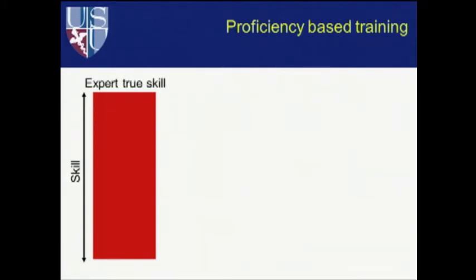So if you have a simulation platform like FLS or FES that has built-in metrics you can measure, you can incorporate this concept that's talked about a lot: proficiency-based training or criterion-based training. There's a bunch of different names that basically mean the same thing. And the concept is this, that any expert at a skill has a certain amount of that skill that they walk around with every day. Any type of validated platform with metrics has the ability to quantify a certain percentage of that skill. How much of that skill gets quantified is going to depend on how well the individual tasks of the training program are constructed, etc. But some percentage of that skill is going to be quantifiable.